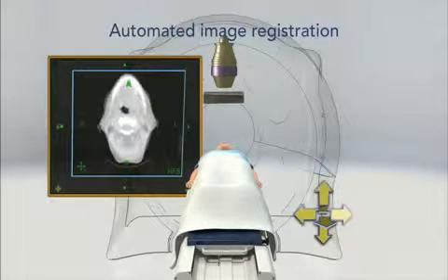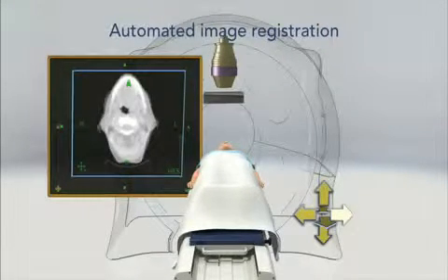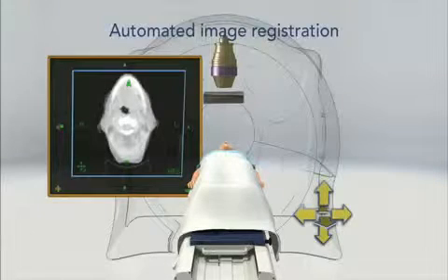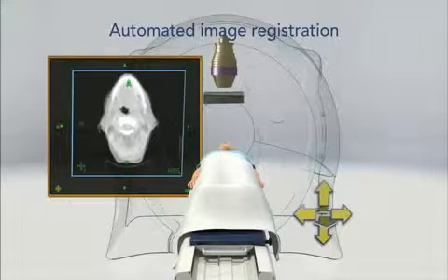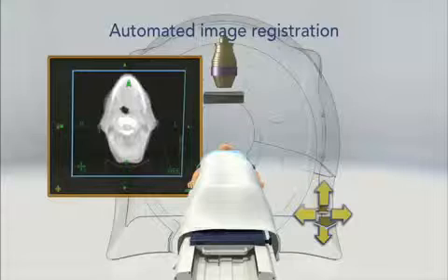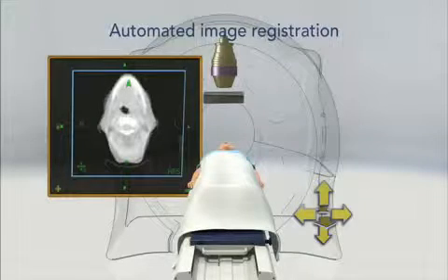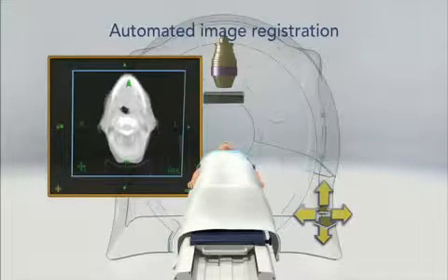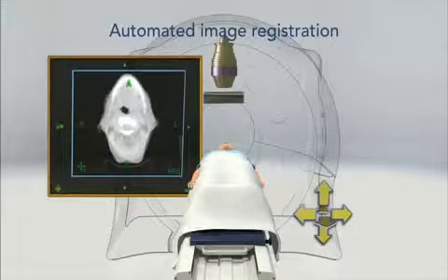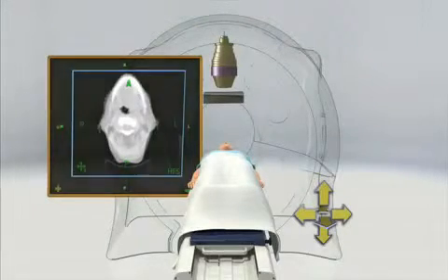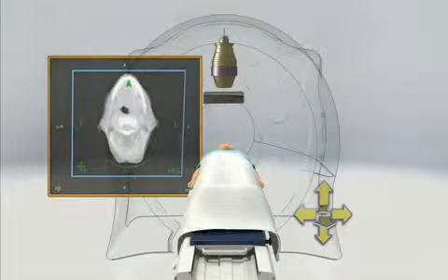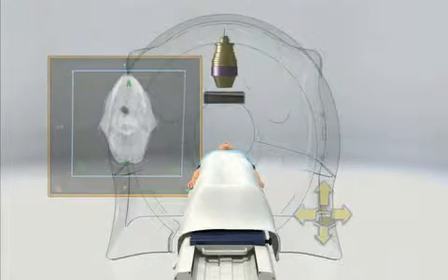Often the tumor itself can be seen on the MVCT images. Once the shift is determined, the patient couch is adjusted accordingly. This procedure is quick enough and the patient dose low enough for it to be repeated on each treatment day, giving clinicians greater assurance of correct daily setup.